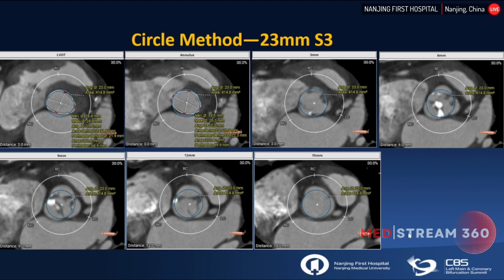Considering there is no severe calcified lesion, we try direct stenting without balloon angioplasty for this patient.